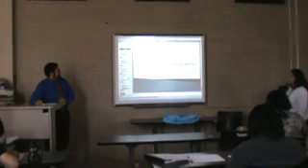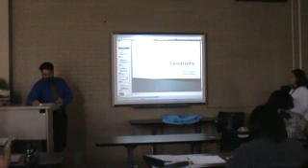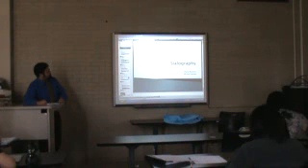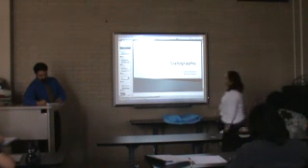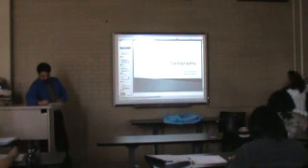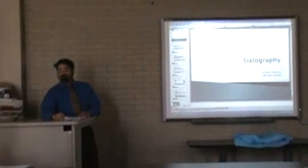Arlene Ramirez and myself are presenting Sialography, which is a radiographic examination of the salivary glands. It usually involves an injection of a very small amount of contrast media into the salivary glands, or salivary ducts of a single gland. And then it's followed up by routine X-ray examination.